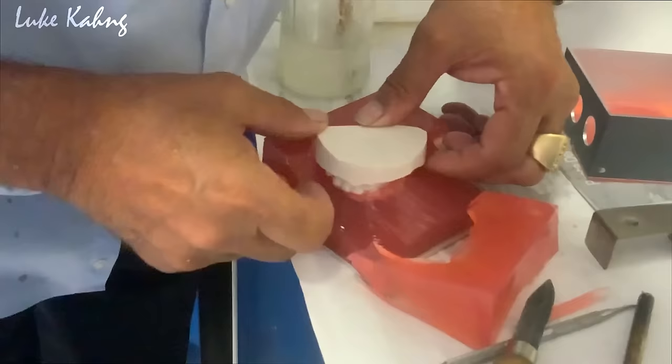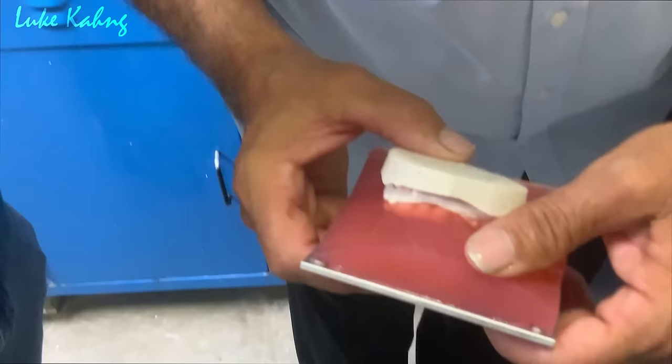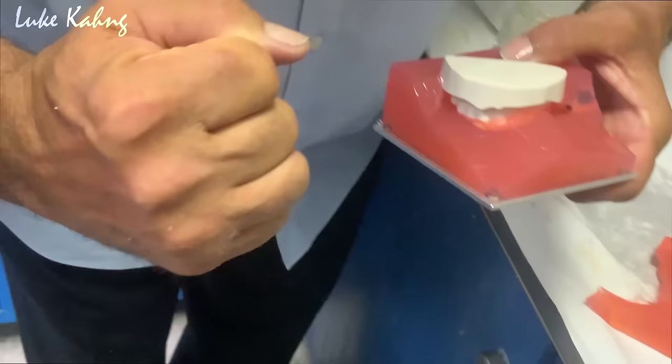You can see if the teeth move here or not. See that? Mm-hmm. You can actually see it. If you try to put it with the paste in there, it stretches and then it moves, or it can move. This way it's more accurate.